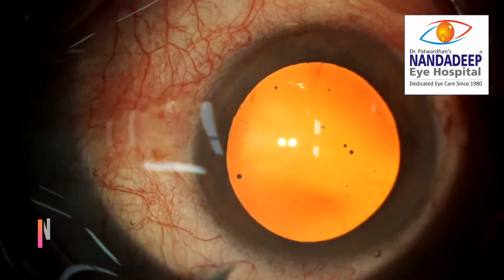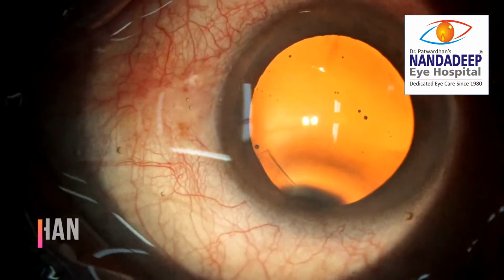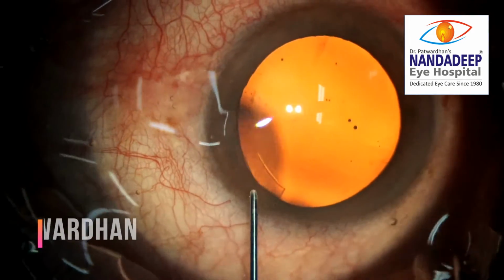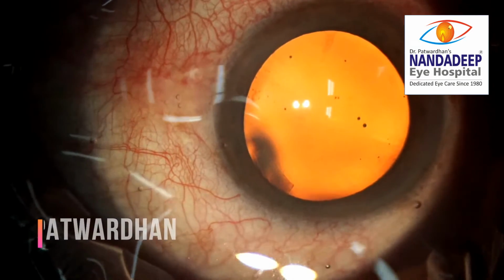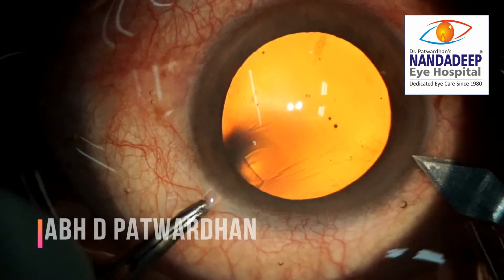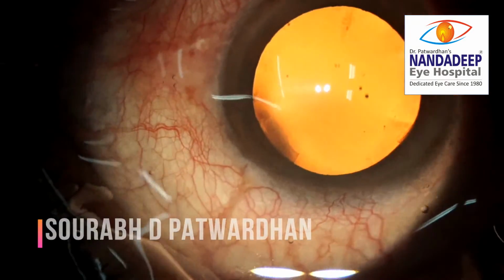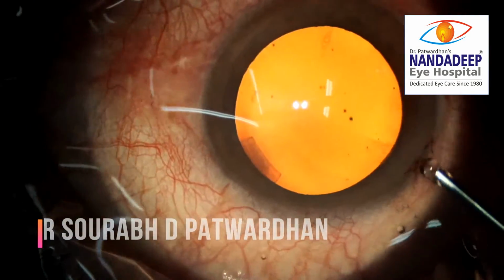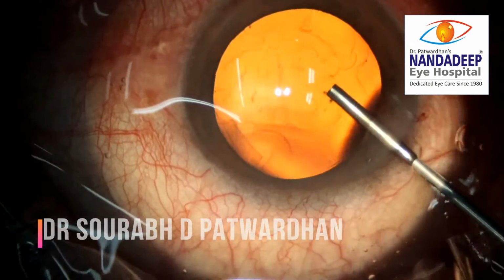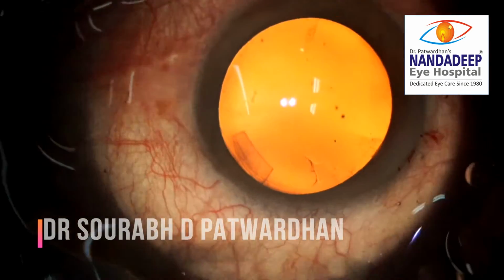Now this is a case I'm operating on topical anesthesia, and as you can see, during making of the side port incision the patient made inadvertent eye movement and the side port was created much larger than what I was aiming for, and obviously as we know that this can lead to a lot of wound leakage. So in this video, I will not talk about just this case, but in general, how to manage the wound leak.